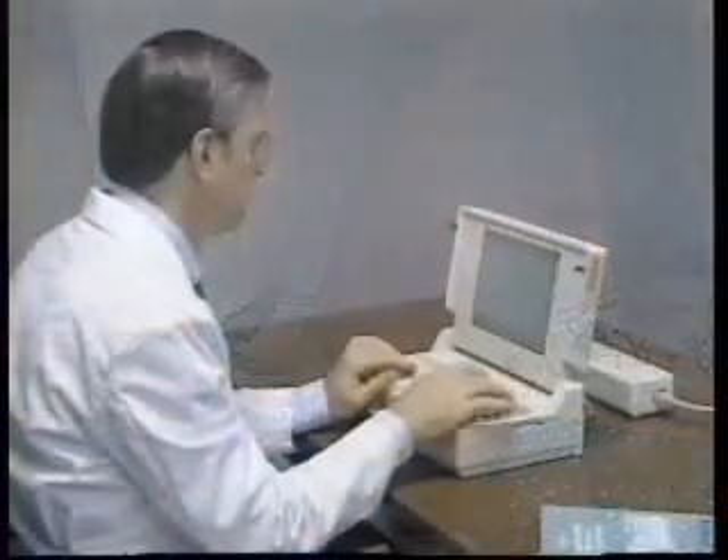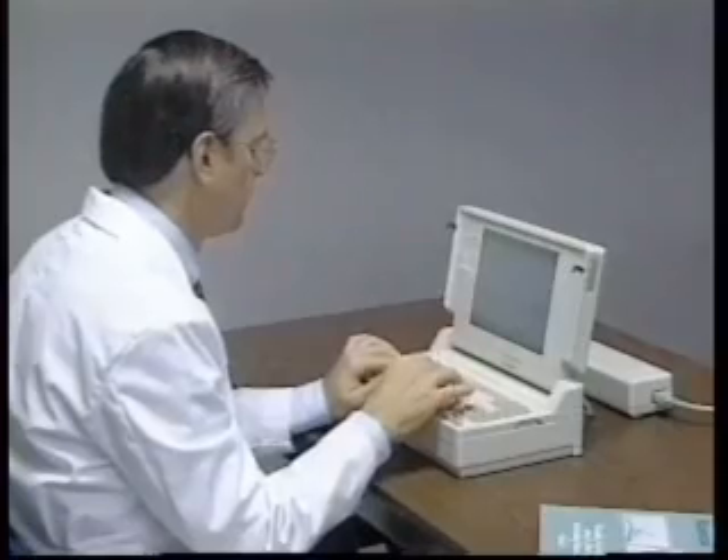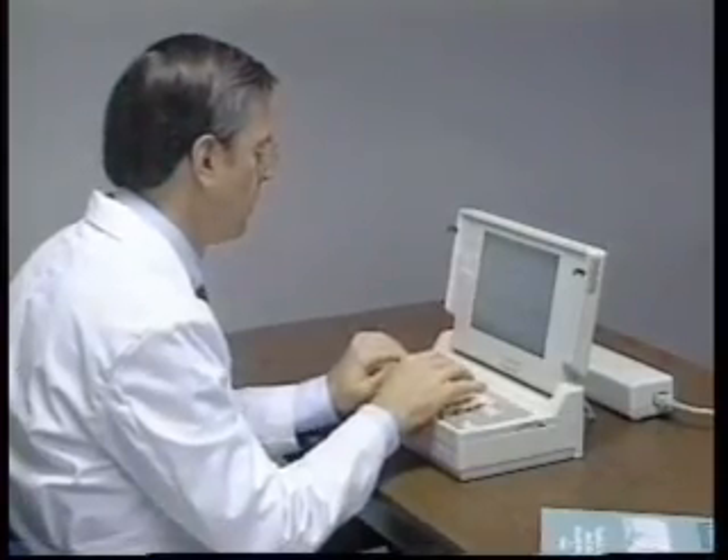On some individuals, it's not possible to separate the fat from the muscle tissue. When a distinct fold of skin and subcutaneous fat cannot be made with confidence, an appropriate note should be entered on the data recording form and a measurement value should not be recorded.